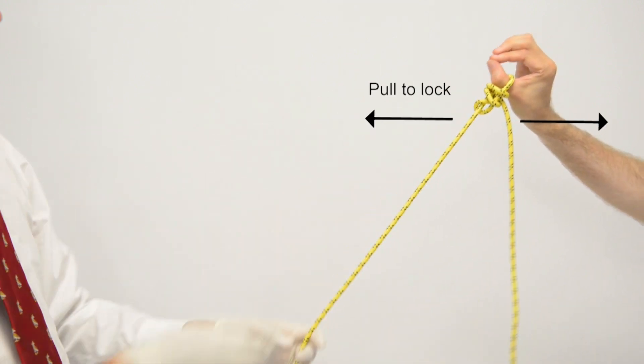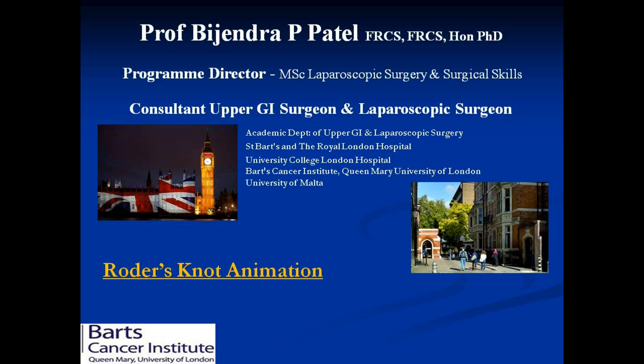Now you can slide it to the desired position and lock the knot by pulling on the two ends.